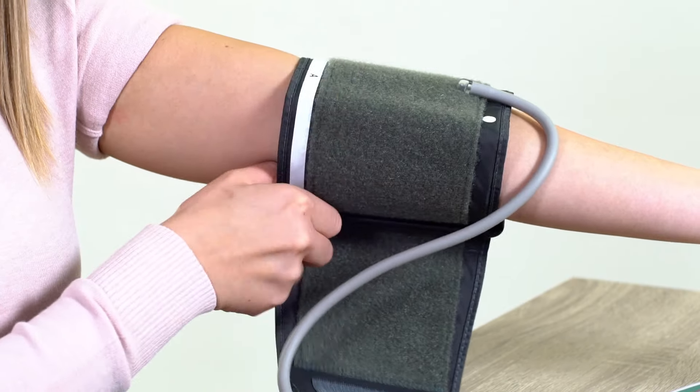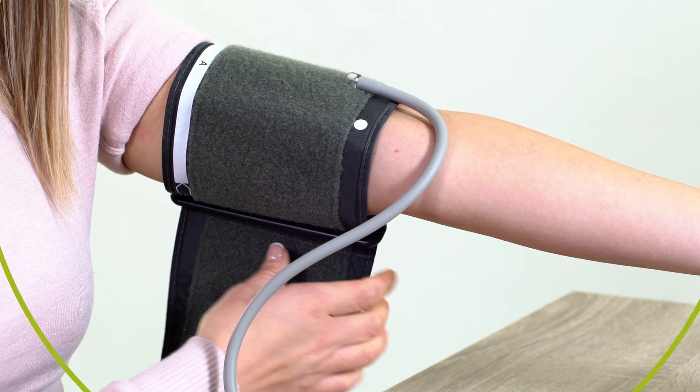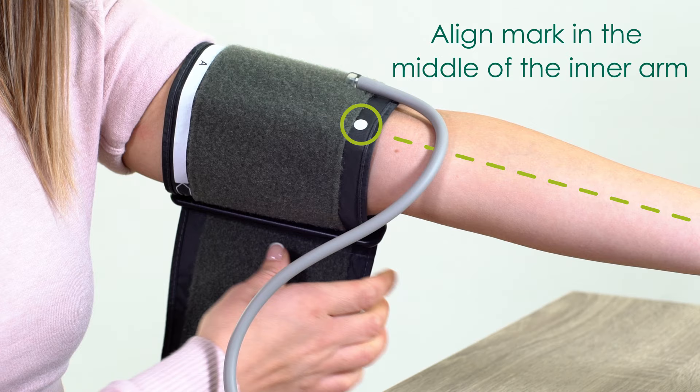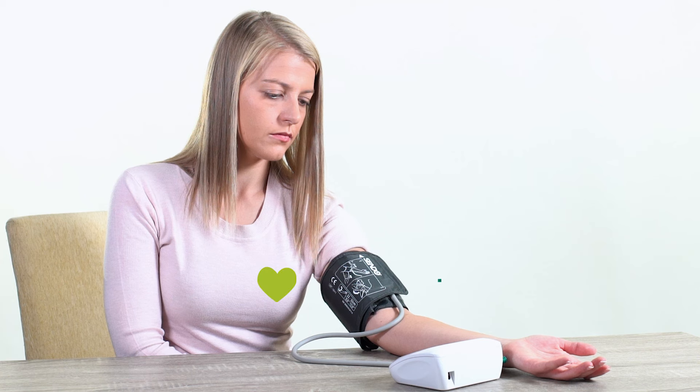Wrap the cuff around your upper arm, making sure it is 1-2cm above your elbow, with the marker lined in the middle of your arm. The cuff should be at heart level.